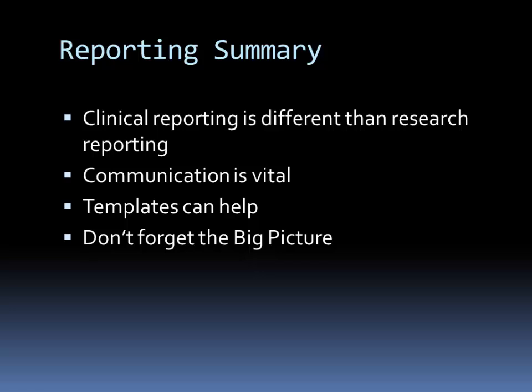Using reporting templates can help, particularly with consistency and completeness. But don't forget the big picture. Remember that this is a patient, and ultimately we're trying to give the clinically relevant information that will allow our referring clinicians to institute the appropriate management for that patient.